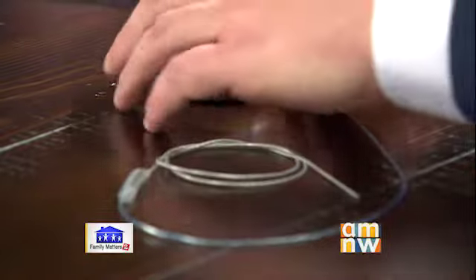Okay, and so where does this device get placed? So ultimately, this goes into the chest. The chest, right there, like a cardiac pacemaker. Wow. Okay. And then the rest of the electrodes go up, past the ear and then up into the head. So how long does it last, and how often do you have to kind of tune up? The benefit lasts as long as the device is in the patient's body, which is typically forever. And the batteries do wear out and need to be replaced on average somewhere from 4 to 6 years. But that's a very minor procedure to replace the battery.